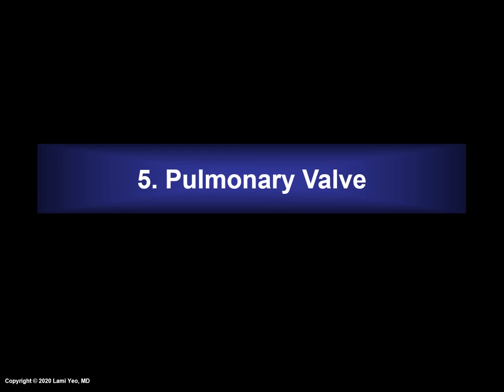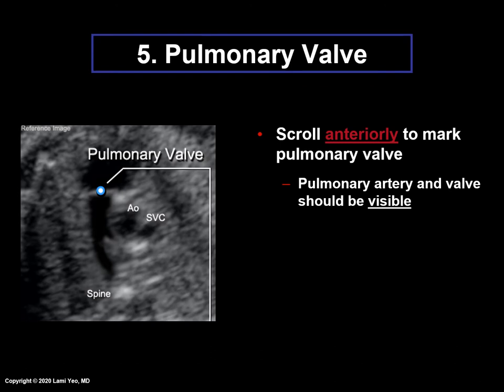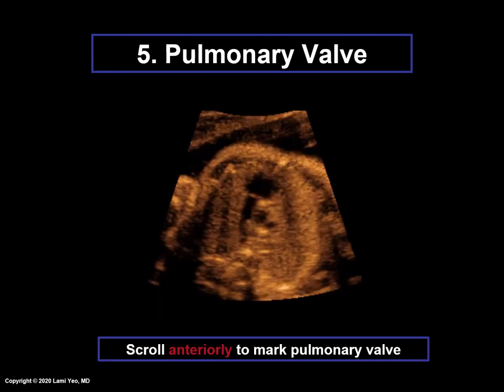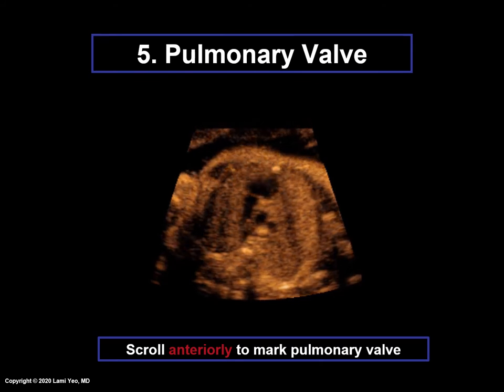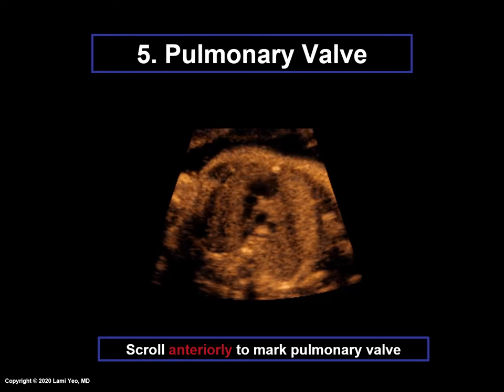The fifth structure to be marked is the pulmonary valve. Scroll as anteriorly as possible to mark the pulmonary valve — the artery and valve should still be visible. Do not scroll too much because then the pulmonary artery and valve will start to disappear. The valve should be closed and appear as a line; then mark the middle of the valve. FINE has automatically presented the plane to mark the pulmonary valve, but the goal is to still scroll anteriorly. If one scrolls too much and the pulmonary artery and valve disappear, scroll the opposite way to find the correct plane.